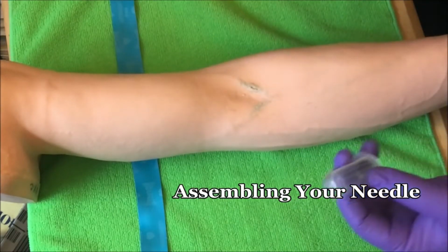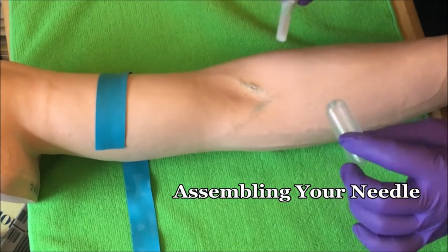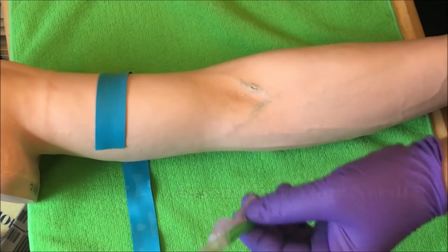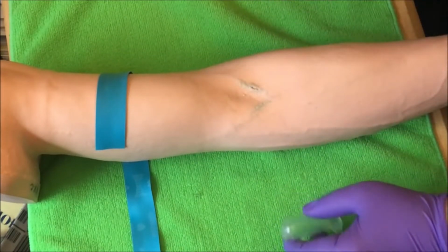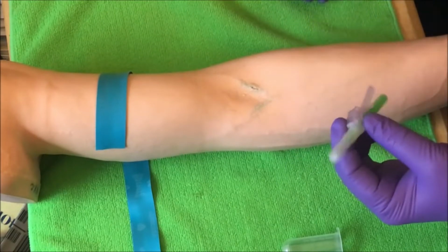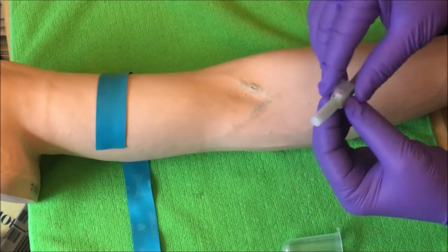All right, before we actually start getting into the steps of collecting blood, I want to talk about assembling your needle here. Now, this is important because I want you to understand that there's, for me, a right way and a wrong way to assemble a needle safely. Most people like to assemble a needle their own way, and I've seen many people, including my students, stick themselves because they had assembled the needle the wrong way.